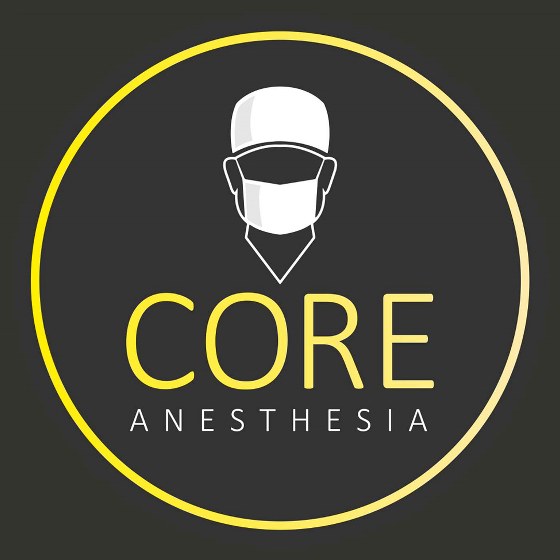For the Mac blade, you're going to go just below, or I guess just above the epiglottis, technically, to lift that up out of the way using that pressure. Both blades, you're going to be lifting at a 45-degree angle up and away from you, not cranking back, watching the teeth. This is going to give you a good view of the cords, and then you're going to place the tube.